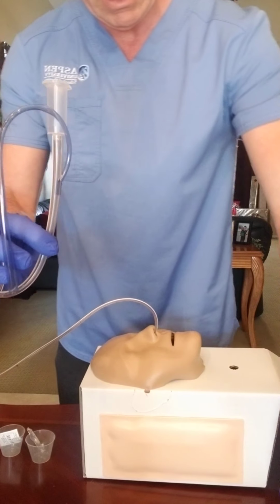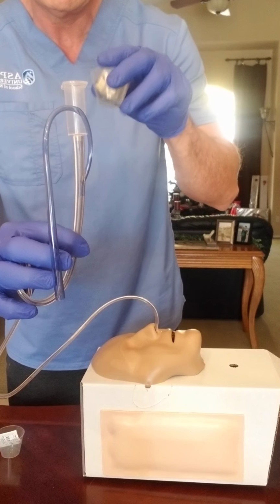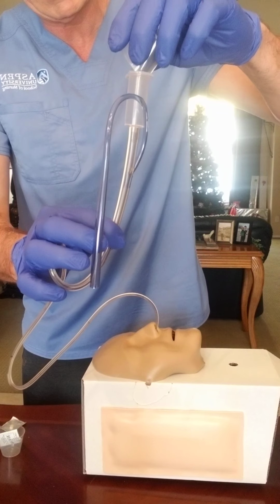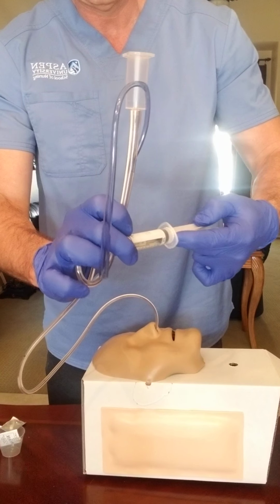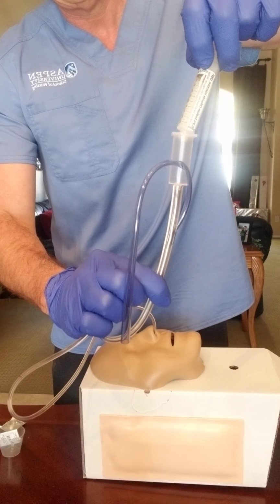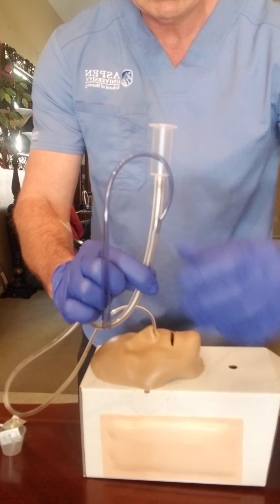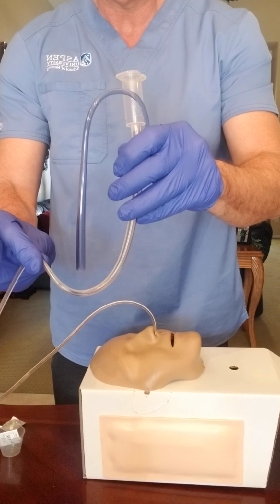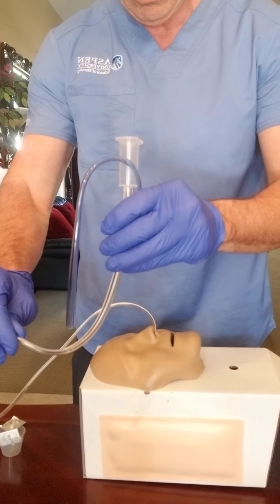So now, with that being said, I'm going to do the first medication, and the medication is in my med cup and it's crushed. It has a little bit of water in it, so I'm gonna pour it in here, and then I am going to kink once again my tube, then pour 10 ml of saline, and let it go down by gravity, and I'll be controlling the flow nice and slow.